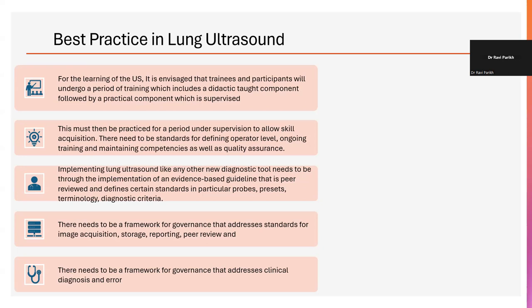is it basically allows you to safely implement your practice with ultrasound whilst you're getting chest x-rays done in those babies as a proxy to start off with, while you're gaining confidence in your ability to perform ultrasound. But more importantly, I would say that it's actually a second marker that you're able to demonstrate pathology on lung ultrasound that's not necessarily picked up on x-ray, or really x-ray working as, I would say, a gold standard or a second adjunctive method of making a diagnosis to confirm that your lung ultrasound is actually picking up the right things. And you've seen that a lot today, where Dr. Ashraf has shown us some really nice images.